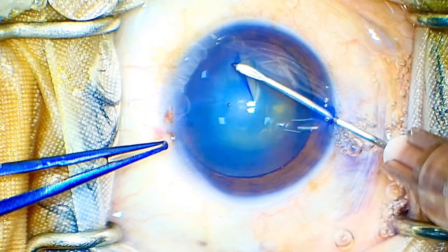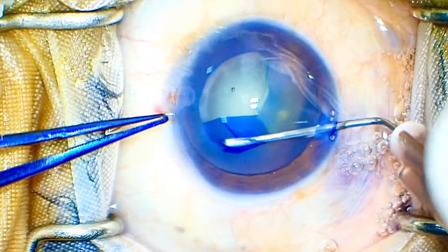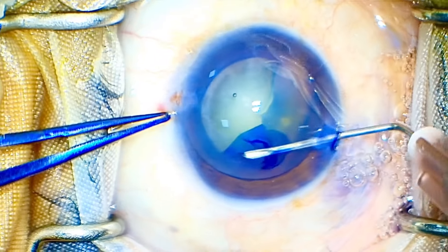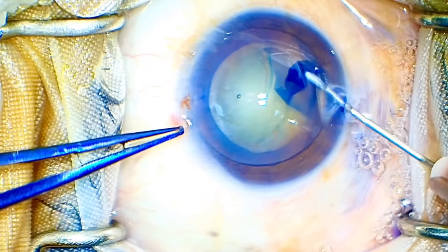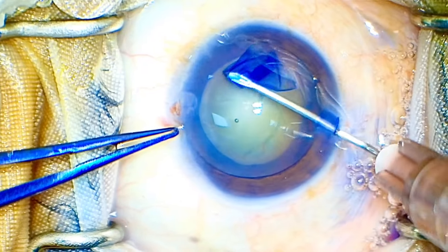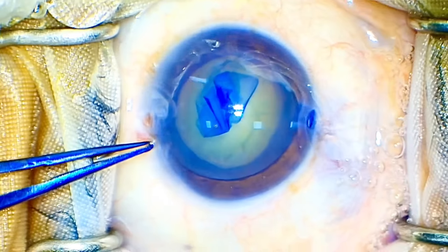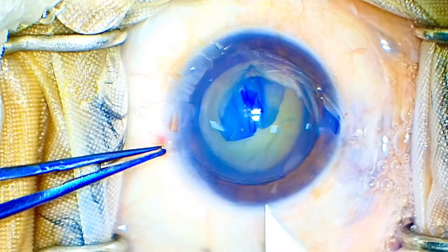I stabilized my globe with the left hand and started the rhexis, just pulling that flap off, noticing the rhexis edge, keeping my eye on it. The nucleus is around grade 3 to grade 4 density — I won't say it's too hard, but neither is it too soft. I have made a decently big-sized rhexis, 5 to 5.5 millimeters — in this case I think it's 5.5.